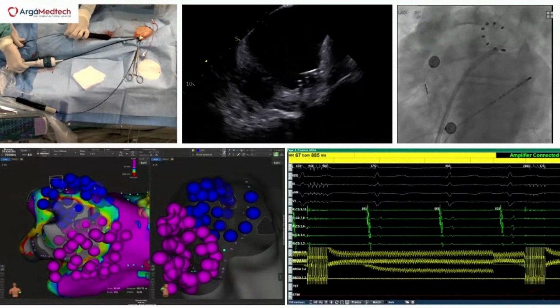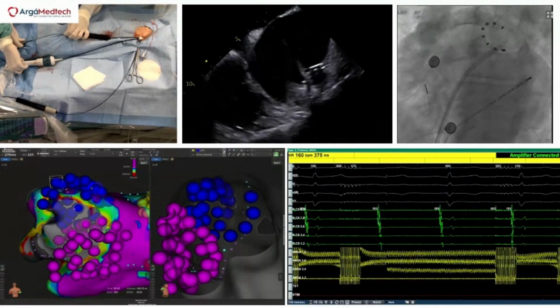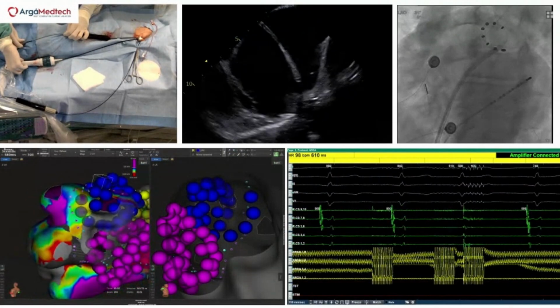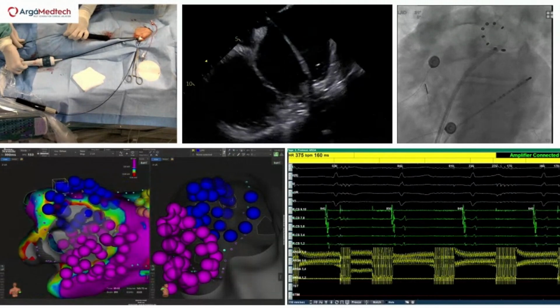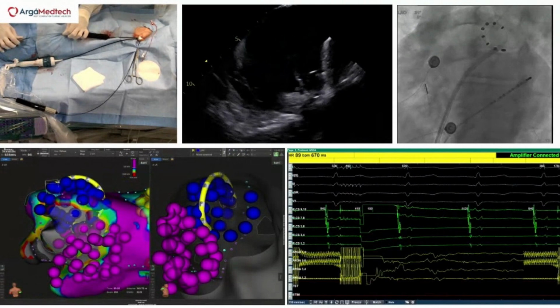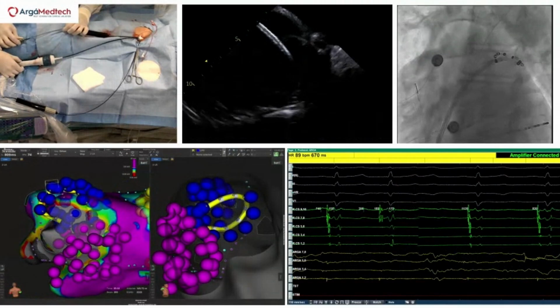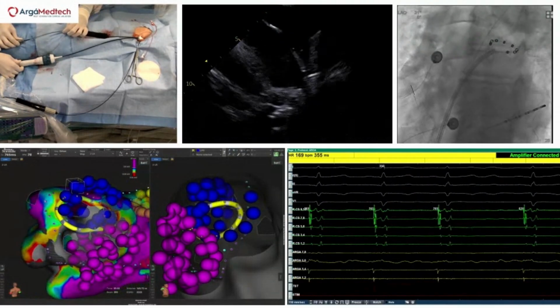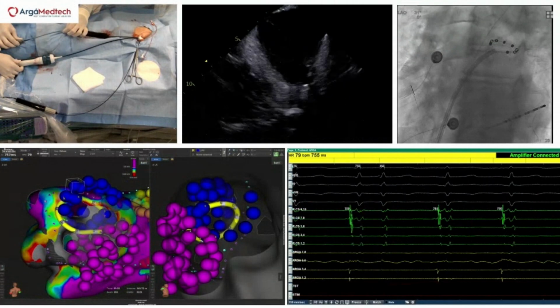So currently, obviously, it's not a seamless integration in the system. There's no prospective contact feedback. So we have to use multimodality imaging to realize where we are touching and where we are ablating. Obviously, the contribution of a 3D mapping system is crucial. This here, good. This is superior, anterior, inferior for the left superior, pulse 5. Go.